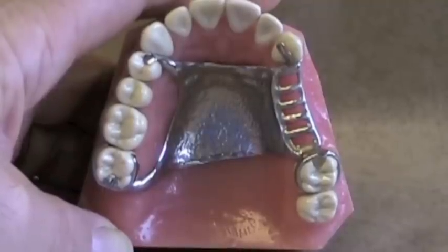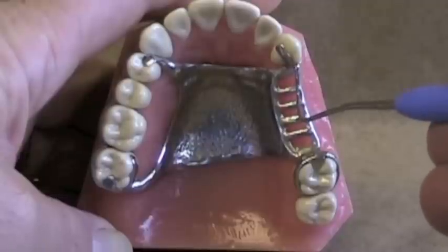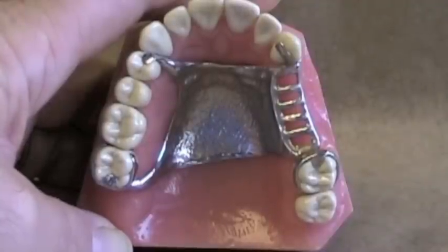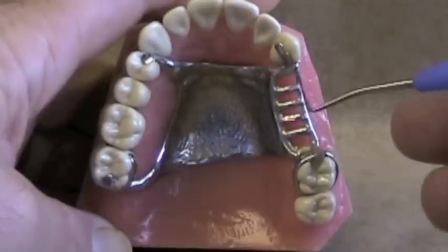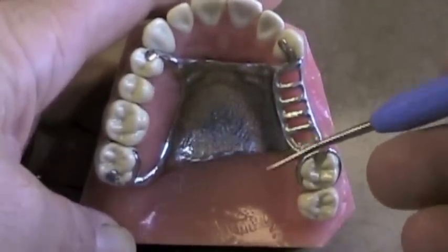Your guiding planes will be more effective if they're parallel to each other. They're also more effective if you place them on more than one surface — on the mesial surface of this molar, the distal surface of this canine, as well as on the lingual surfaces of the molars. All those different surfaces help dictate that single path of insertion more easily. It's also important that if you have guiding planes that directly oppose each other, those are going to be more effective than guiding planes that do not oppose each other.